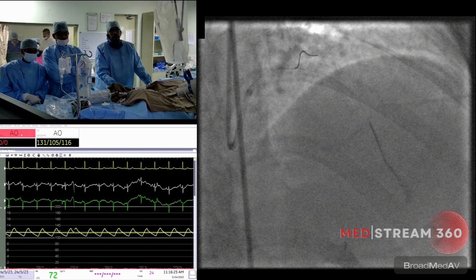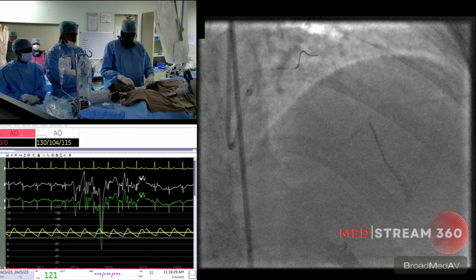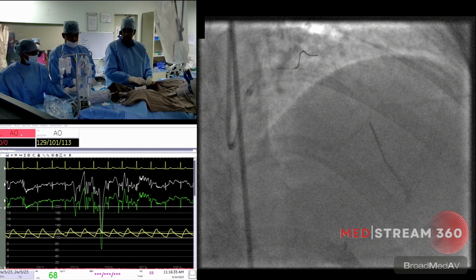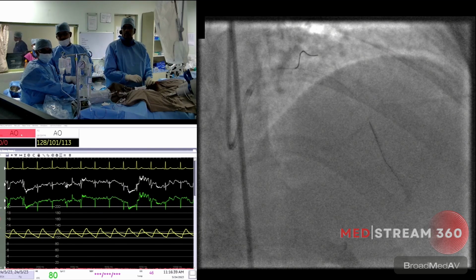Since it is a 28 millimeter stent, I think maybe we can divide the stent into two halves, before the diagonal and after the diagonal, and we can measure the expansion. And at last, we are going to see the ostial LAD, whether during this catheter manipulation, any block has got disrupted or not.